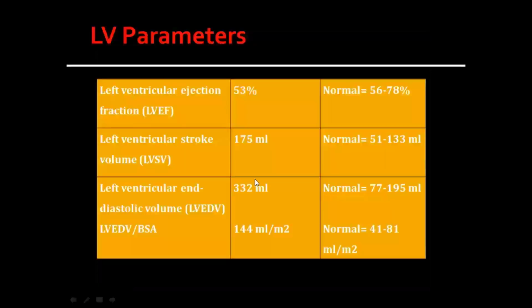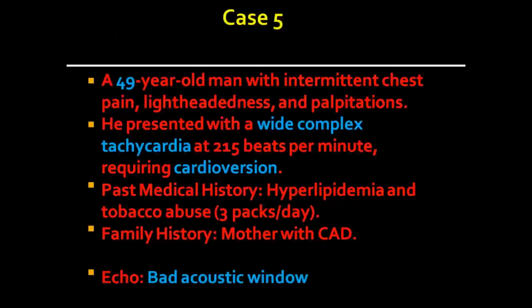However, the measurements by MRI show that the end-diastolic volume is huge, is high, and the ejection fraction was actually borderline. It's not 68. It's really actually 53. And this would change the decision. Instead of watchful waiting of his aortic regurgitation, the patient was operated on immediately.